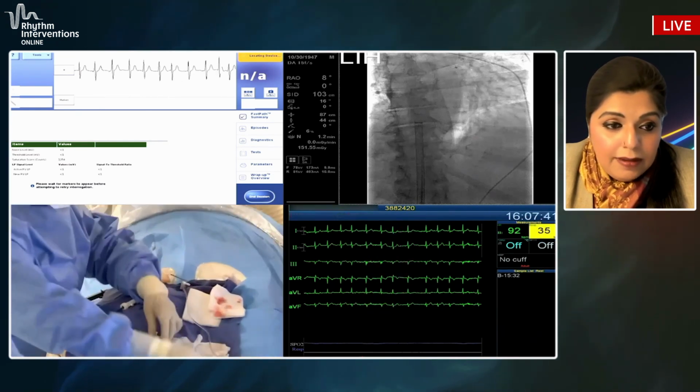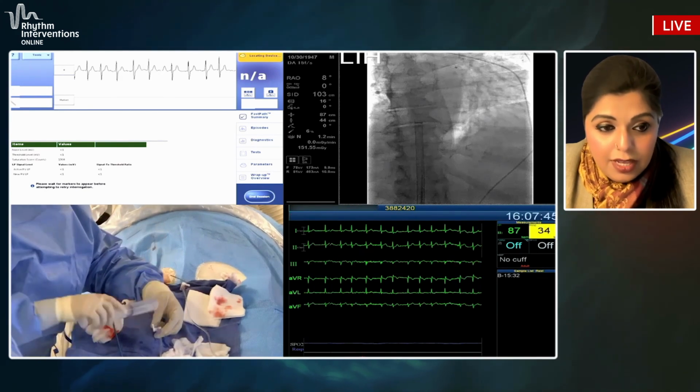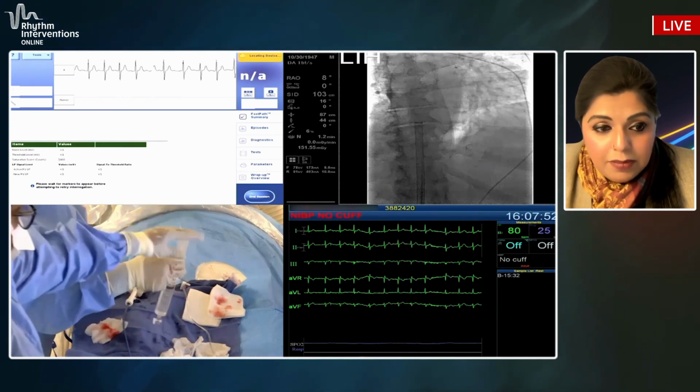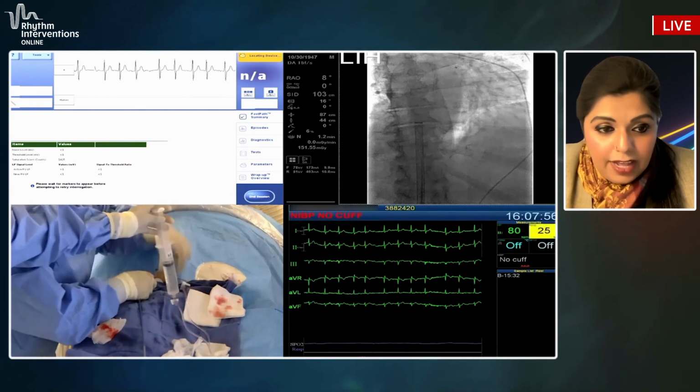Now, at this point, you're getting ready to come in with the delivery system, and the protective sleeve is at the end, and you want to cover that protective sleeve with what's called a valve bypass tool. That helps get through the sheath. So that white thing up here is the valve bypass tool. And what I'm doing here is connecting a 50 to 60 cc syringe on the side port of that valve bypass tool.